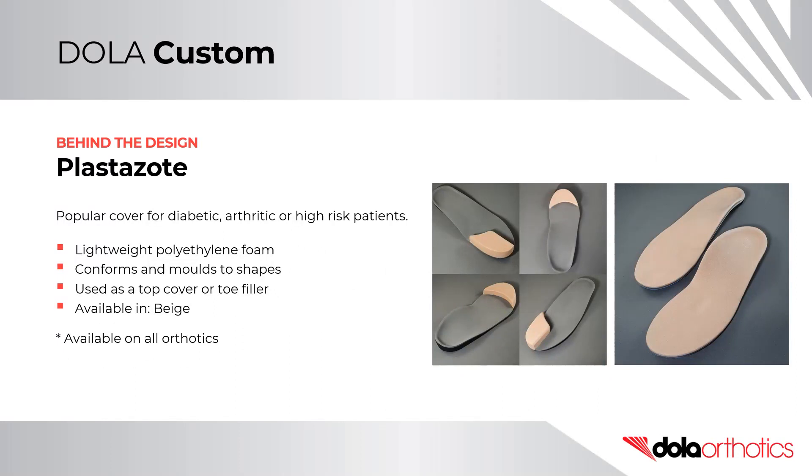Plastazote is a popular cover for diabetic, arthritic, or high-risk patients. It is a lightweight polyethylene foam which conforms and moulds to shapes. It can be used as a top cover or a toe filler, and is available in beige. It is available on all of our custom or prefabricated orthotics.